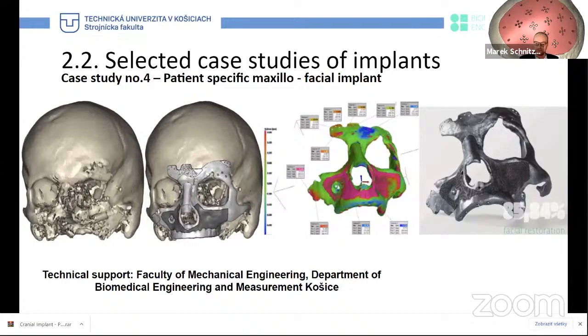The skin needs to be stretched because the implant is rigid, but he's in a very good condition. He's taking care of the implant, so he needs to have a scheduled regime for how to live with the implant, but his perspective is that in 2 years he will be without any extra care with the implant.